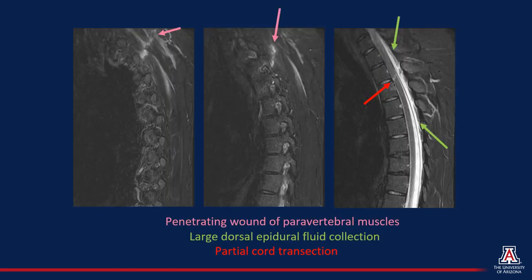Based on the CT findings, an MRI was recommended. The MRI images are shown here, with STIR images on screen left demonstrating a soft tissue stab wound extending to the level of the thoracic spine, indicated with the pink arrow. On screen right, there is additionally a large dorsal epidural fluid collection pointed out with a green arrow, as well as a partial cord transection pointed out with the red arrow.